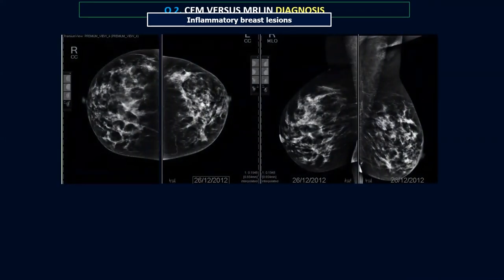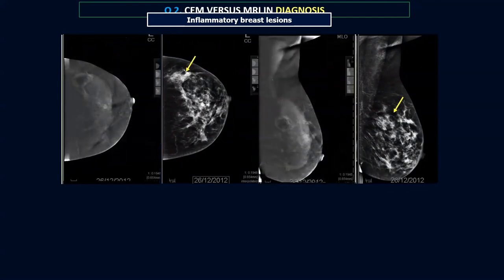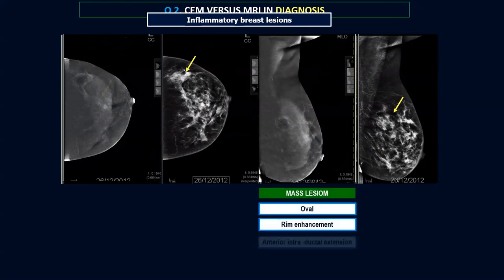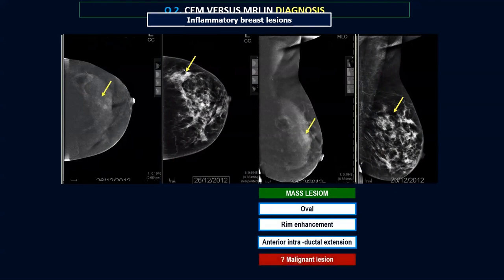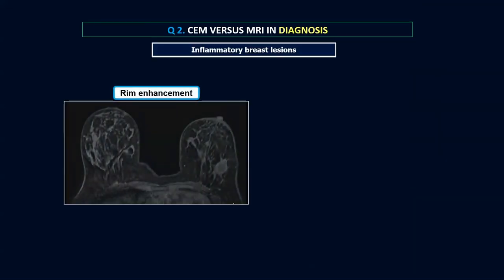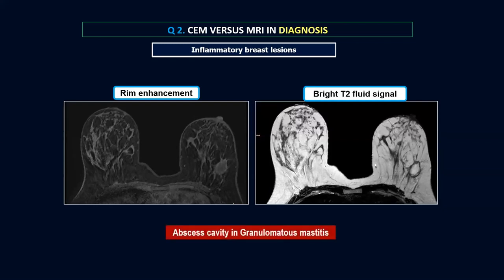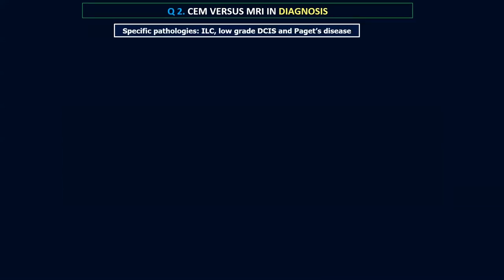One applied example: a patient presenting with inflammatory signs of the left breast had a focal asymmetry in the left upper outer quadrant. Her contrast mammogram showed an oval lesion with rim enhancement pattern associated with anterior intraductal extension — all signs pointing to a malignant lesion. However, with a simple look on her MRI, the T2 and dynamic images showed that what was inside the rim enhancement was simply a fluid signal on T2-weighted image — this was an abscess cavity in granulomatous mastitis, not a malignant lesion.